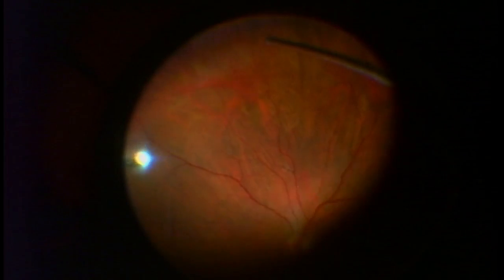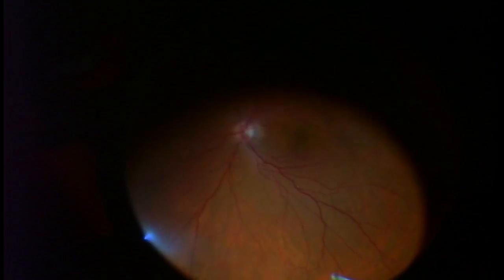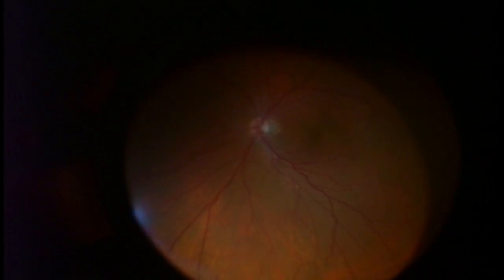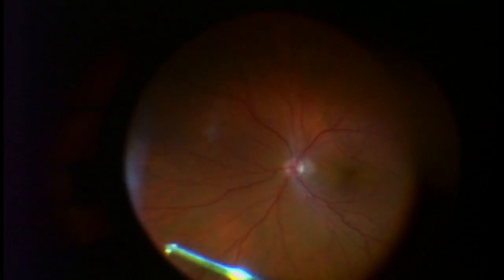The rest of her retina is very normal. I don't see any evidence of disease, holes, or tears. There's certainly no retinal detachment. What I want to do after I've removed most of the central vitreous is go around to the sides, inspect the retina to make sure it's healthy, and also remove as much easy vitreous or peripheral vitreous as I can.